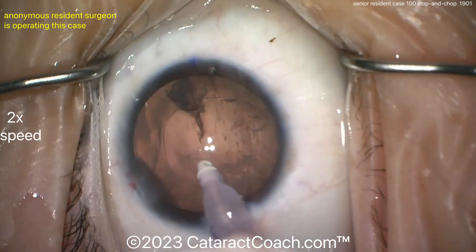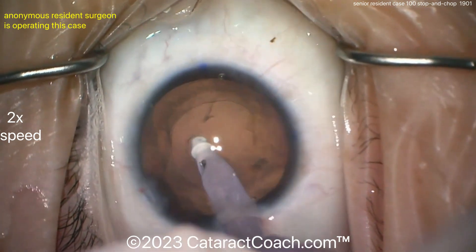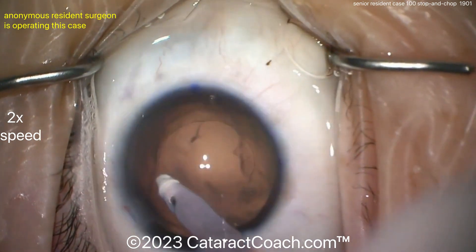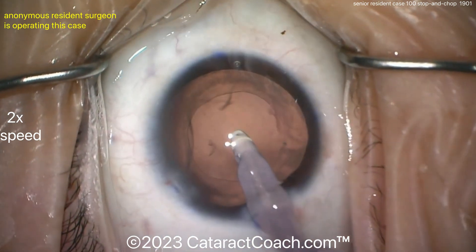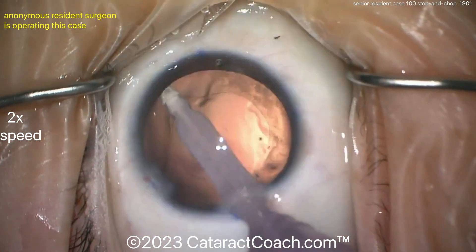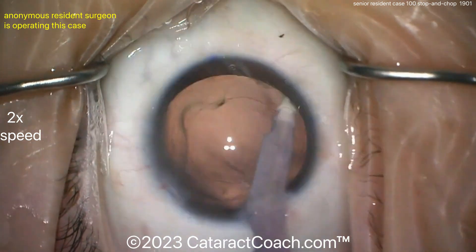This new generation of surgeons who grew up playing video games — there's some incredible hand-eye coordination out there, really impressive. Now cleaning up the capsule bag. For case 100, you don't have to do too much polishing — that's pretty good. Cleaning up under the surface, the anterior capsule being vacuumed off a bit.